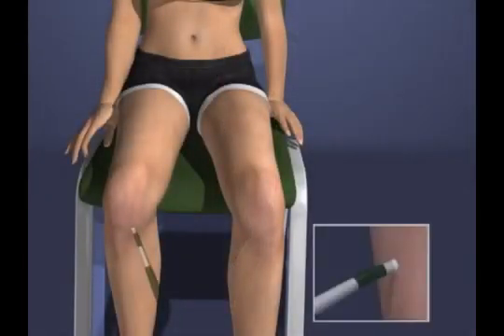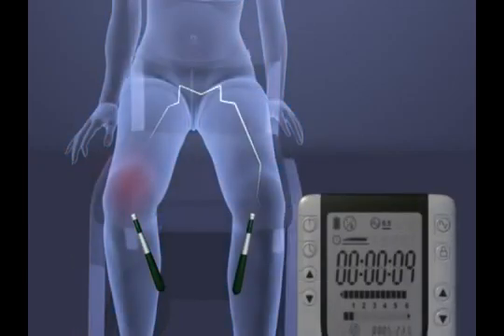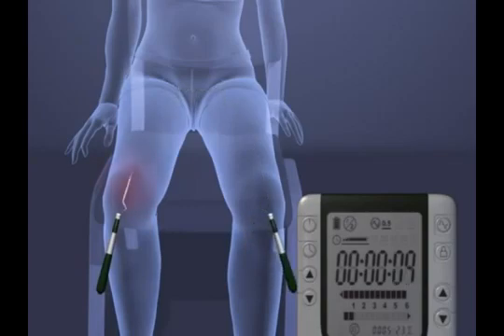Connect the 2 sides of the body. Place one probe below the treatment area and the other in the same place on the opposite side. Repeat in a few places. For example, visualize a line under and around each knee, placing the probes at intervals along the line all the way around the leg below the knee.